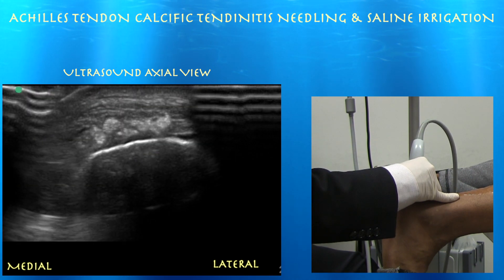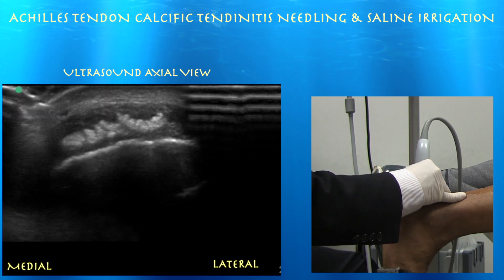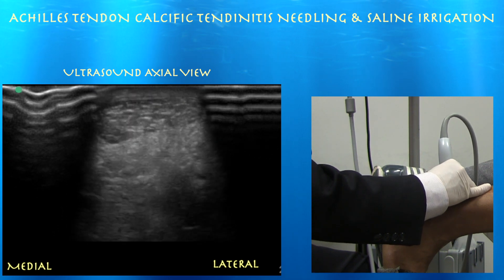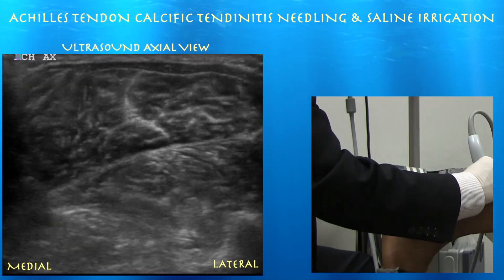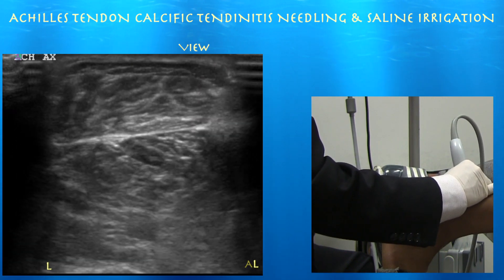It could be a gouty-type tophus, but I don't believe there's any history of gout. Now we're going back proximally, and here is that retrocalcaneal bursitis right underneath. It's thickened as it gets distal, but otherwise the tendon does not look torn. Going down in depth from proximal to distal, here you can see the soleus and deep flexors of the leg, as well as the deep compartment under the soleus.